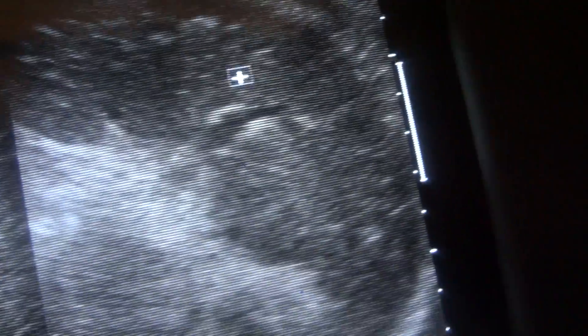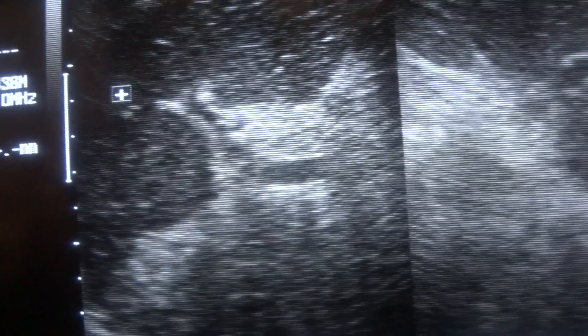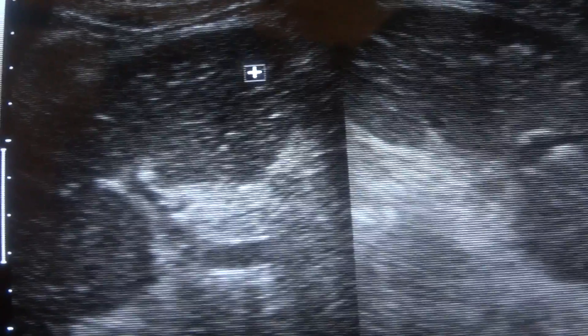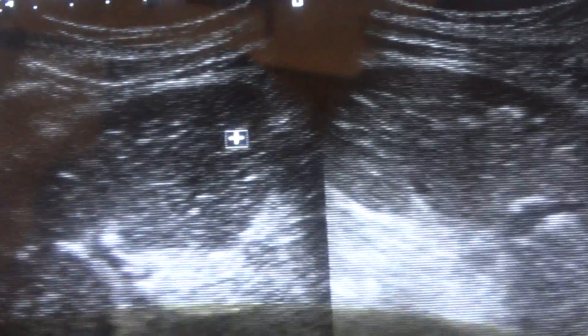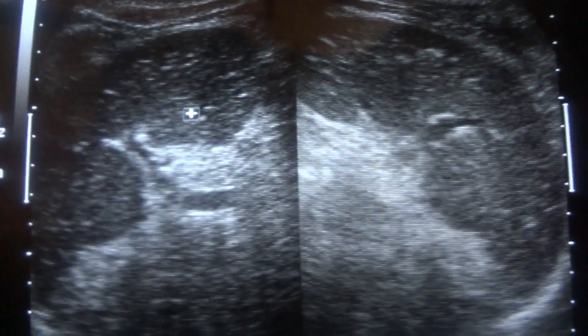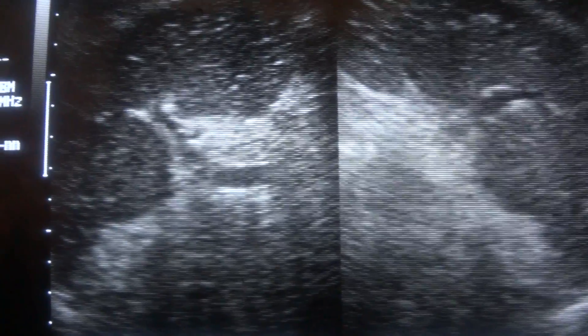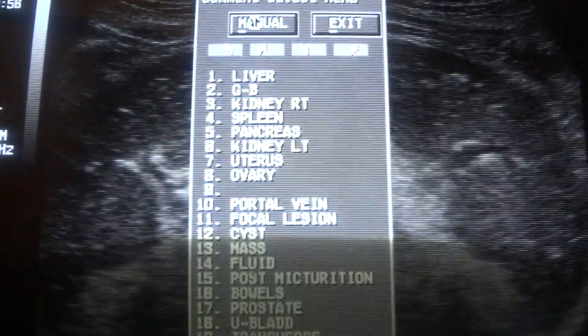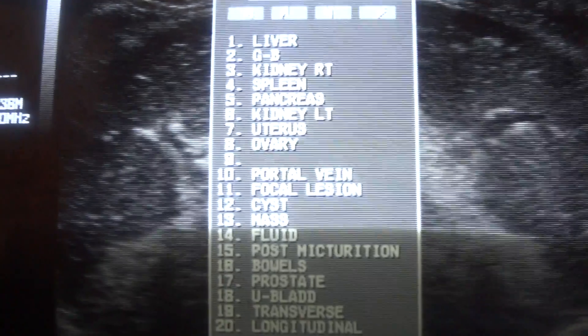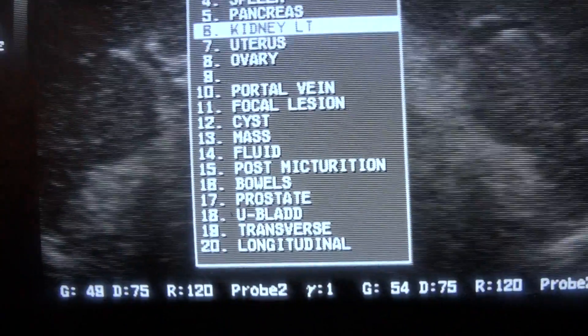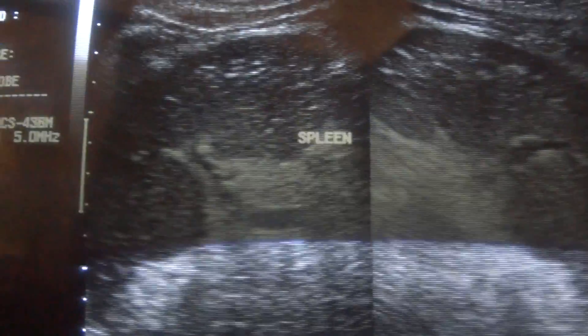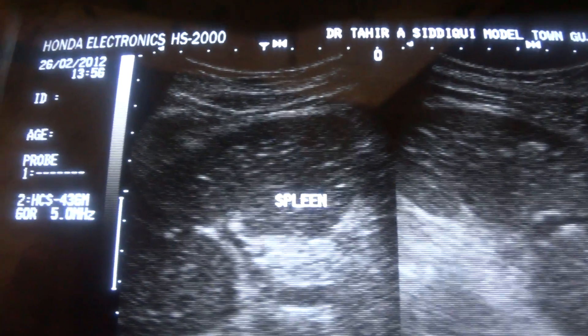This bright area, and this one, and all these bright, tiny, shiny areas are related to — there are so many echogenic areas, tiny. They are actually representative of vascular radicals.